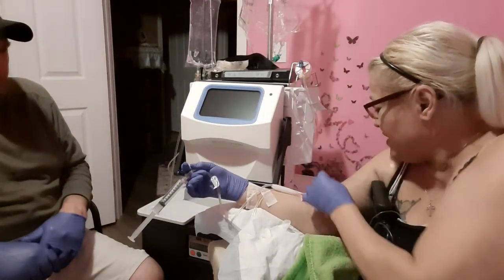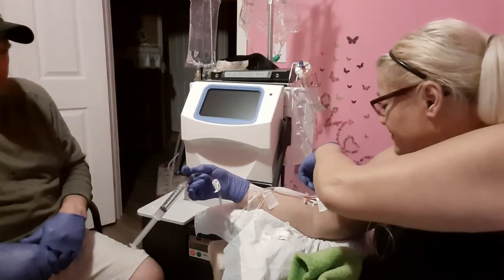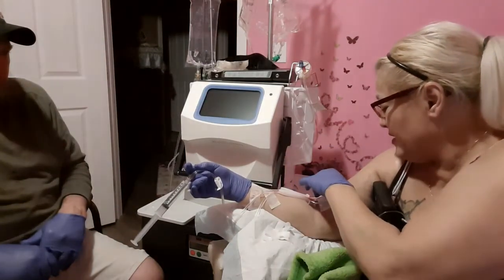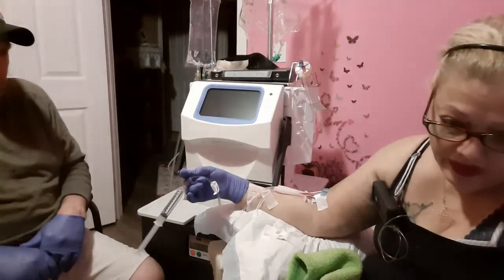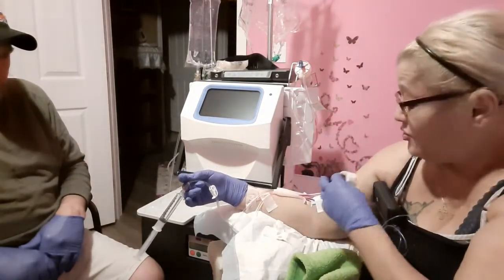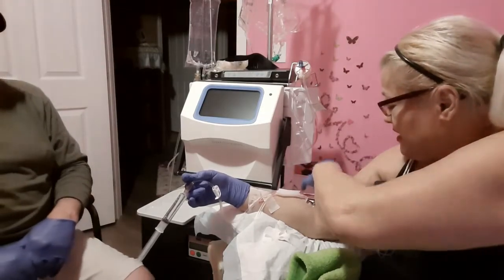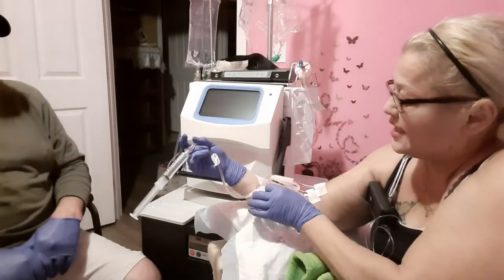And what I do is I start with the venous, and I take off the tapes. I take the wings off from the bottom up towards me. Start from the bottom up towards me, peel them right off. Then, one of these little buddies that I made earlier, remember I made 6 of them? So I used 2, I have 4 left. You'll see why. So I'm going to tape over the syringe site. Then I'm going to remove the tape that's holding the line.